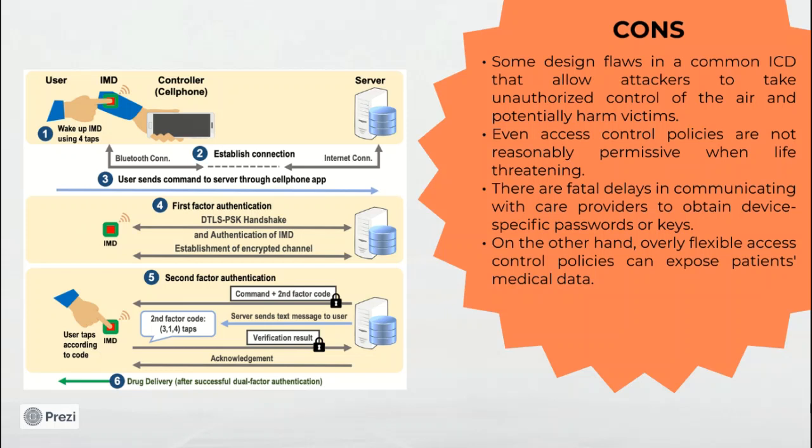Even access control policies are not reasonably permissive when life-threatening. There are fatal delays in communicating with care providers to obtain a device-specific password or key. On the other hand, overly flexible access control policies can expose patient medical data.